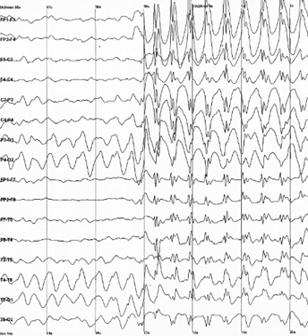Alpha is the frequency range from 7 Hz to 13 Hz. Hans Berger named the first rhythmic EEG activity he saw as the alpha wave. This was the posterior basic rhythm, also called the posterior dominant rhythm, or the posterior alpha rhythm, seen in the posterior regions of the head on both sides, higher in amplitude on the dominant side. It emerges with closing of the eyes and with relaxation, and attenuates with eye opening or mental exertion. The posterior basic rhythm is actually slower than 8 Hz in young children, therefore technically in the theta range.